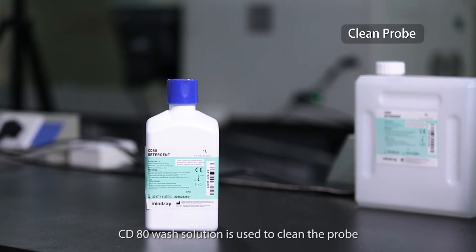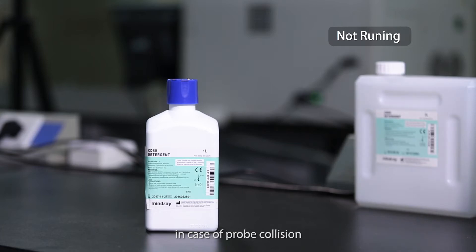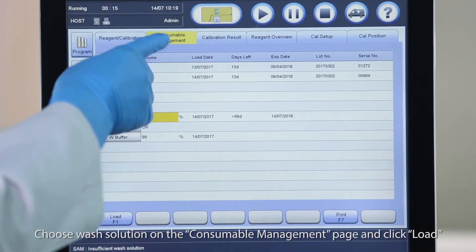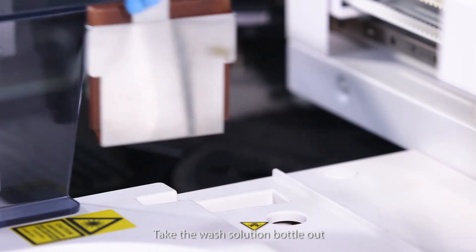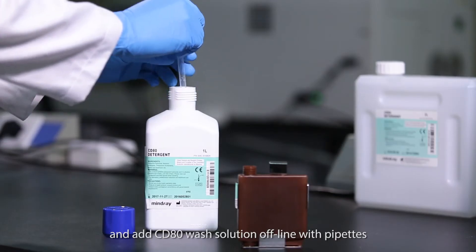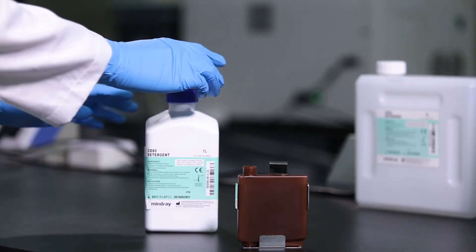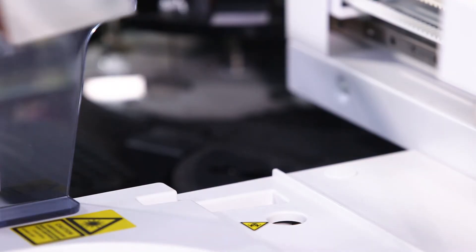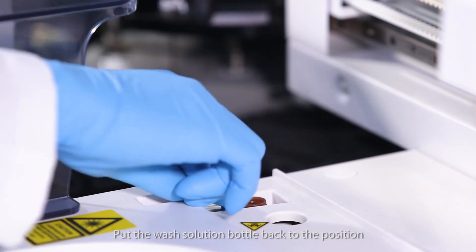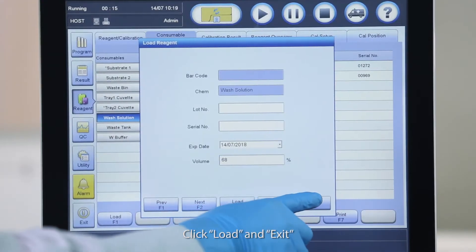CD80 wash solution is used to clean the probe. If the wash solution is used up, you can replenish the bottle when the system is not running in case of probe collision. Choose wash solution on the consumable management page and click load. Take the wash solution bottle out and add CD80 wash solution offline with pipettes. Do not add when bottle is still on the machine. Enter the following information: volume and expiration date. Put the wash solution bottle back to the position. Please make sure it will not block the probe movement. Click load and exit.